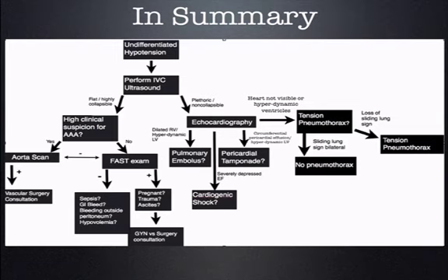Now at this point we've covered a lot, so I want to review this with you before I give you a couple of cases just to test what you've learned. So this is the whole algorithm that we've covered. So let's review this now.